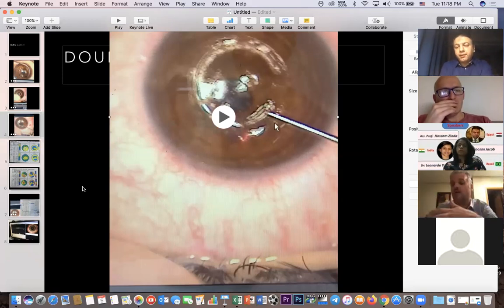Yeah, so if I found a high axial length, I treated with a ring, then with a phakic IOL. Yeah, okay. So I think that's a very good point Dr. Rafay made, that you have to look at the axial length also. But sometimes we tend to attribute all the sphere to keratoconus, and that is not always the case. That is really not always the case.